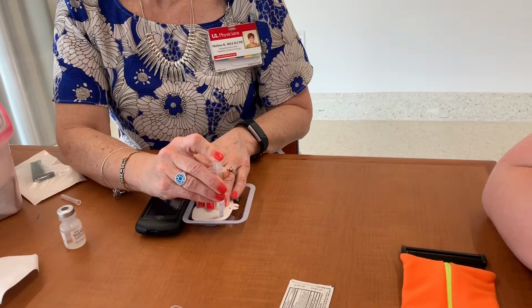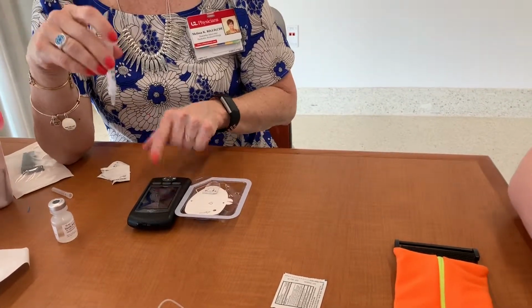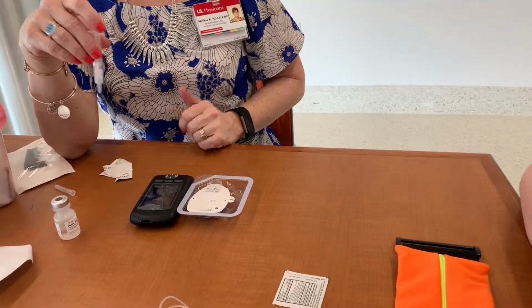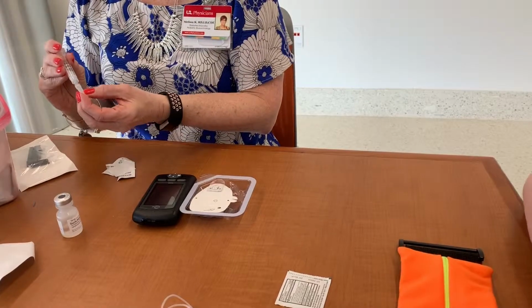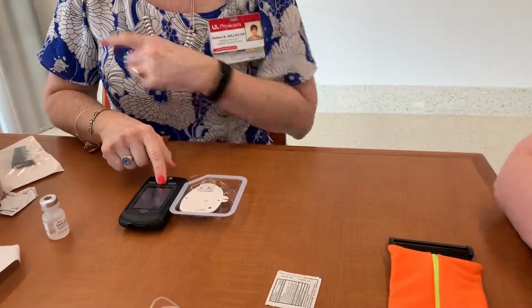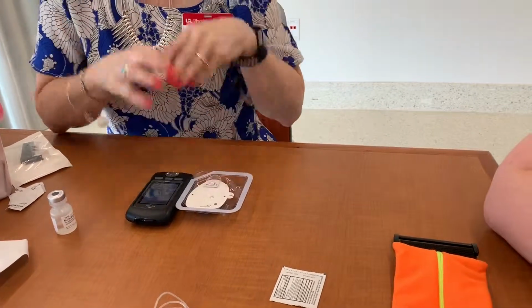Did you hear the beep? That means it's active. So any basal rates, remember basal's that little trickle? Now it knows what all my basal rates are. How cool is that? So it connects. And you keep the needle and the syringe? Nope. So you don't reuse it. So every pod comes with a new one.